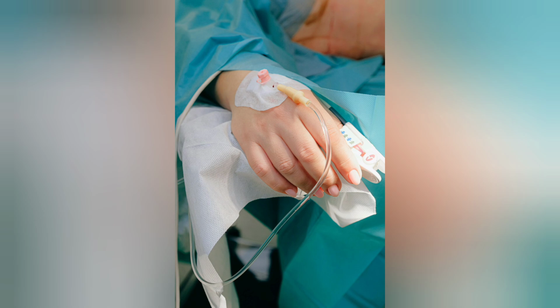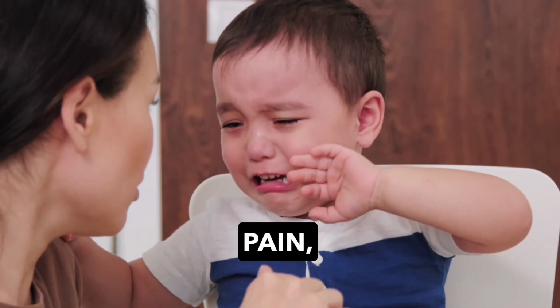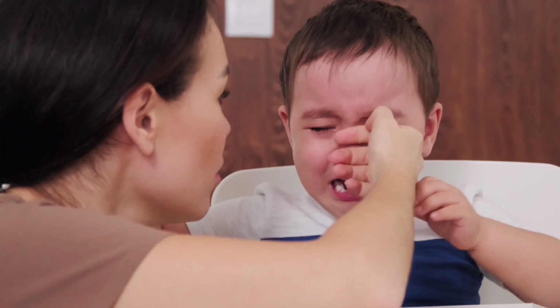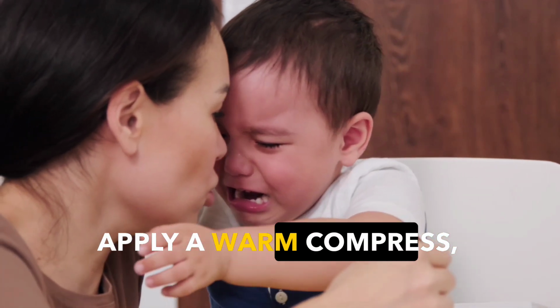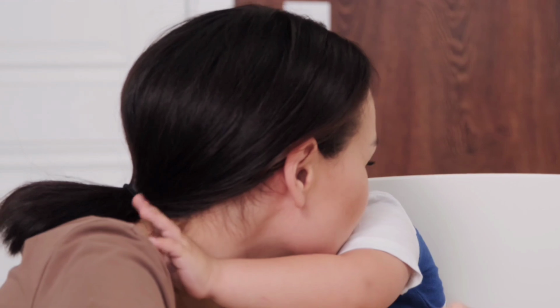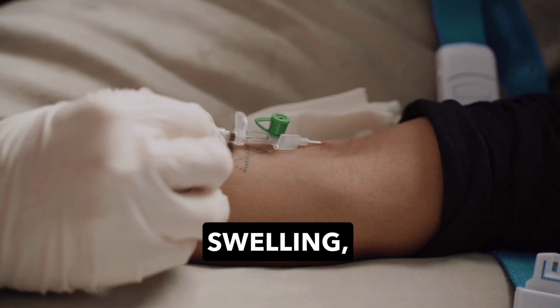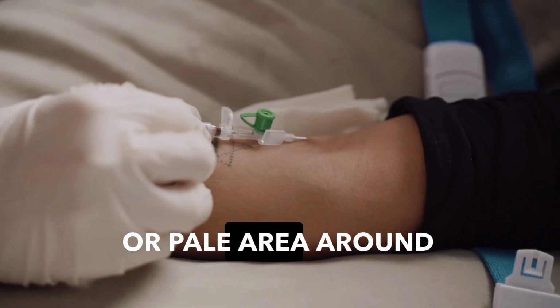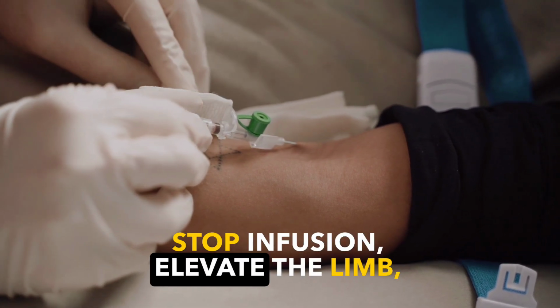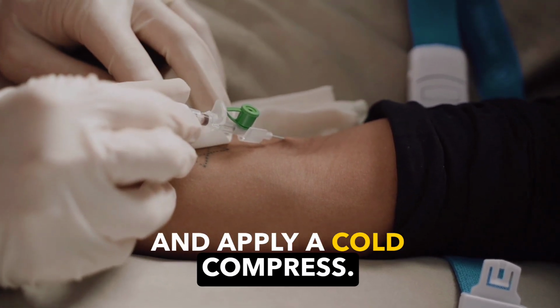Complications: 1. Phlebitis. Signs: pain, redness, swelling along the vein. Action: discontinue the cannula, apply a warm compress, and restart in another vein. 2. Infiltration. Signs: swelling, cool skin, or pale area around the site. Action: stop infusion, elevate the limb, and apply a cold compress.